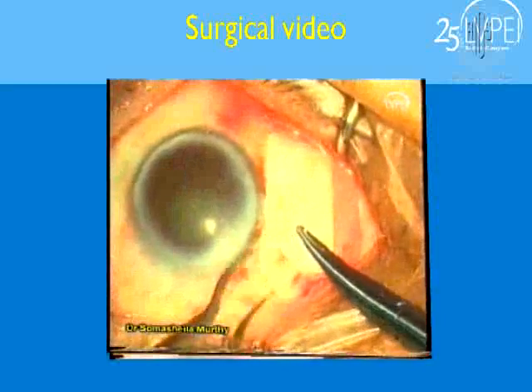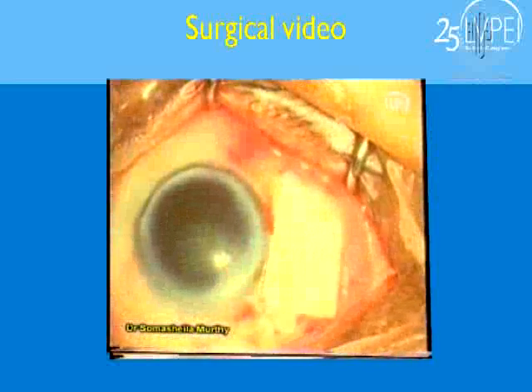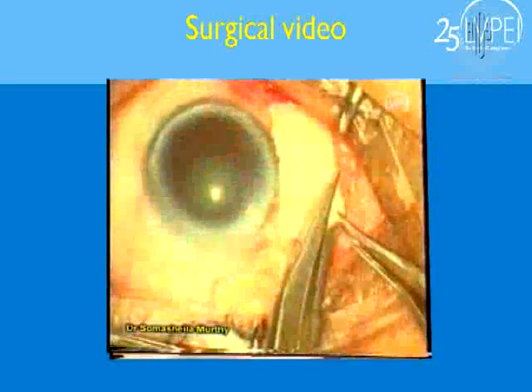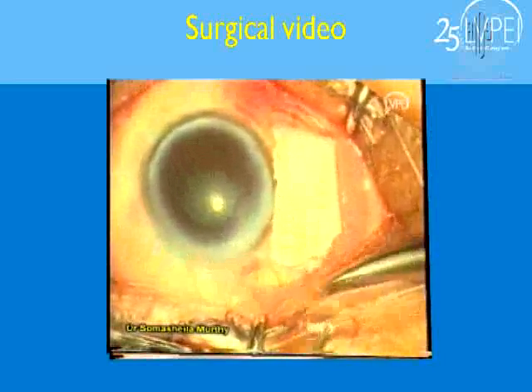Perhaps it would be good to put in cardinal sutures, and the rest of it you can use fibrin glue and just tack it down in place with the help of glue. So this is trimming the graft to fit snugly over the area of defect in the eye. So again, this patient did very well.